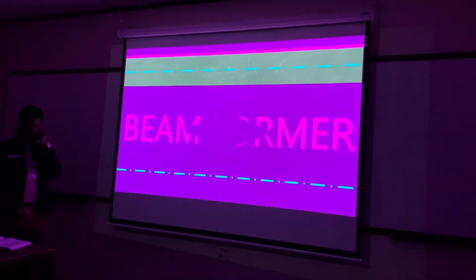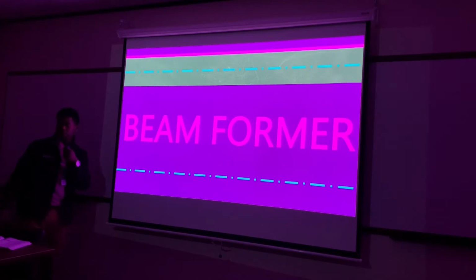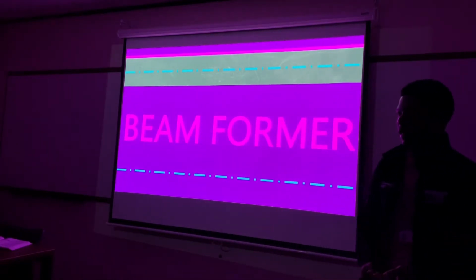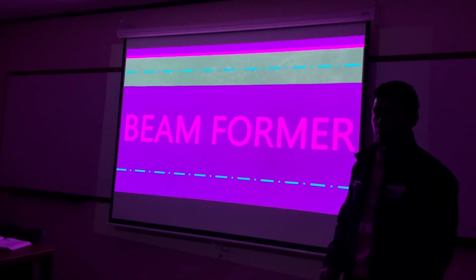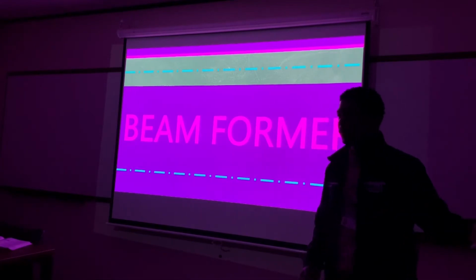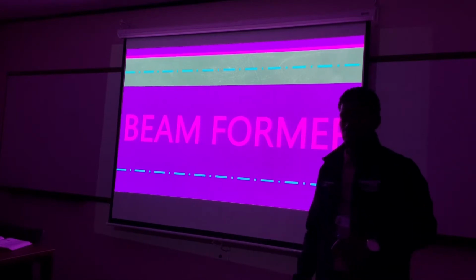So, next thing up, guys, we have the beamformer. What did I say the beamformer does? It forms the beam. It's going to steer and focus our beam. It's going to communicate with each PZT element and tell it how to react. It's going to send those electrical signals created from the pulsar. So the electrical signal is going to go from the pulsar to the beamformer. The beamformer is going to distribute the total strength of that sound into each PZT element.